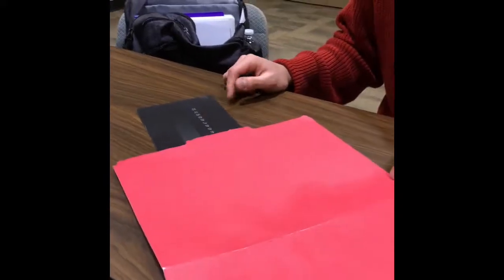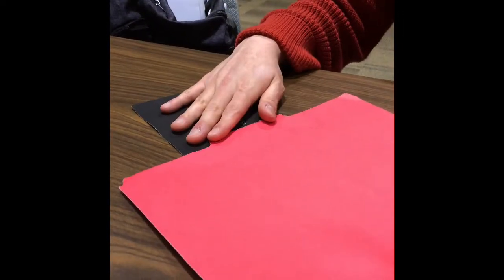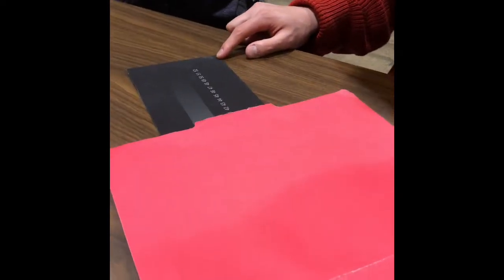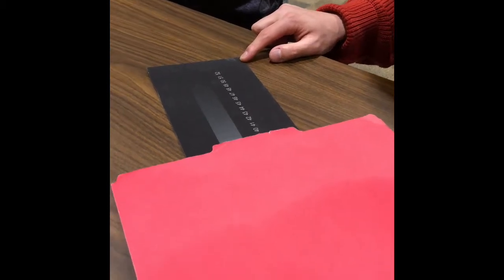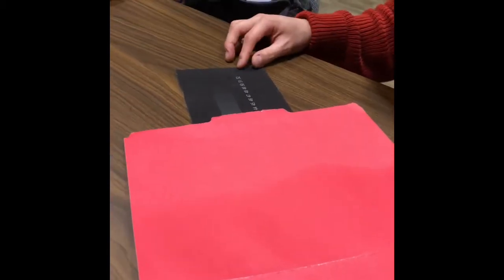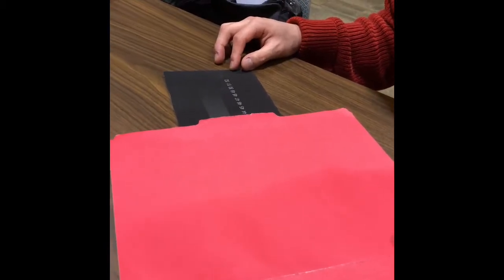So when the lights are immediately turned off, we cover all of the gray boxes with the red folder, and then slowly start to reveal lighter and lighter boxes until the patient is first able to see the grayscale box on a dark background. And then when he can see it, we record the number at time 0, and then we repeat the process every minute to 2 minutes in the dark.